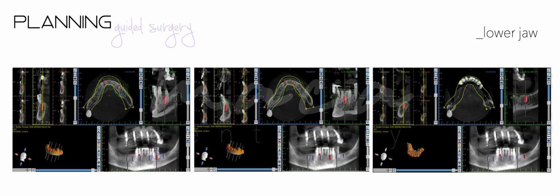As I said before, we did the guided surgery, and the OMNI abutments were also planned in this specific software using both the CBCT and the STL files from the intraoral scanner. Then the superimposition of the files was done, and then the implant position was planned in the software.